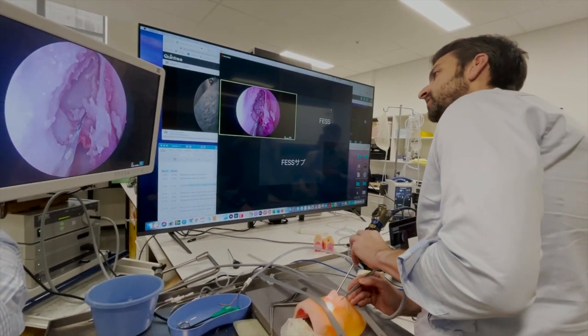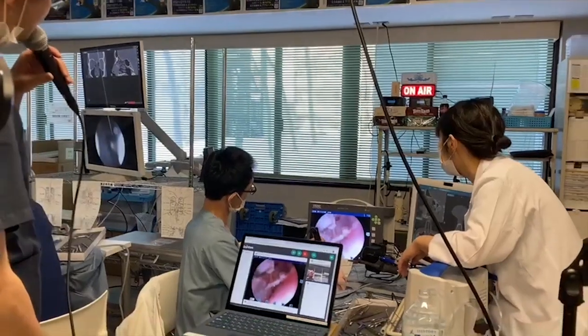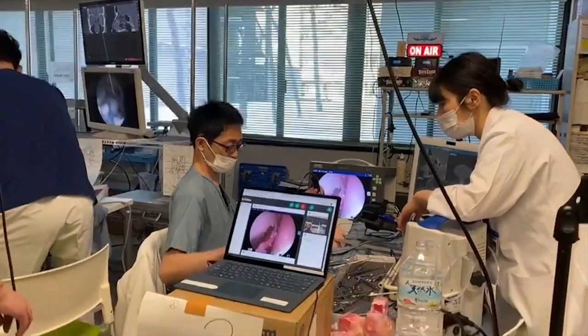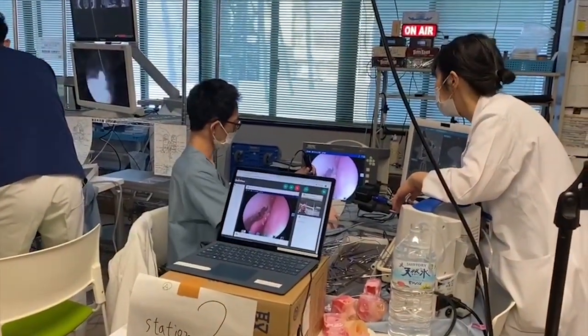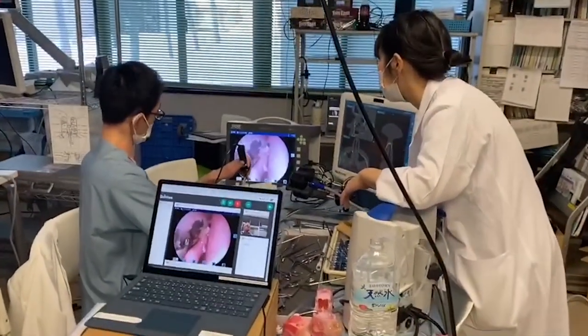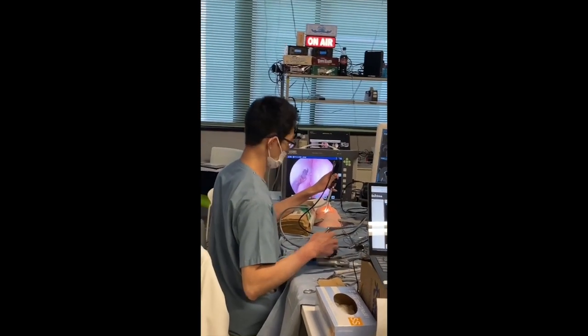The thing we should do now is to improve our access for our instruments. We want to remove the front face of the suprabullar frontal cell so we can get an angled instrument, because as you can see here, the access is very, very tight. I would use the curette here.